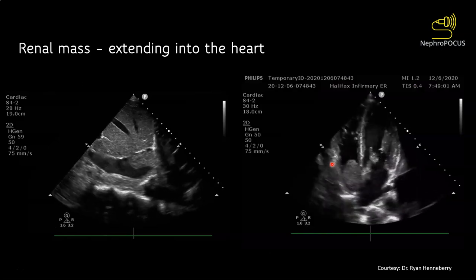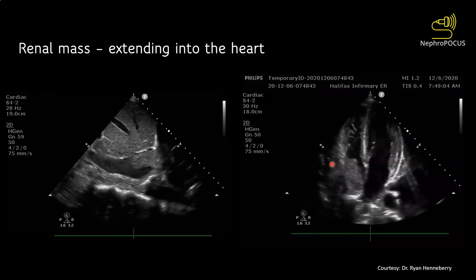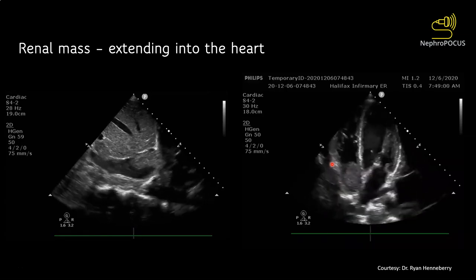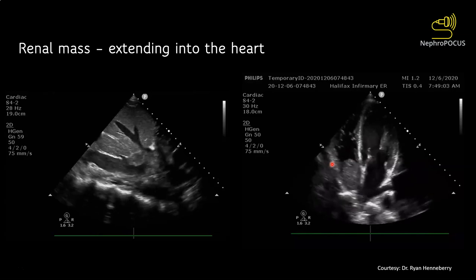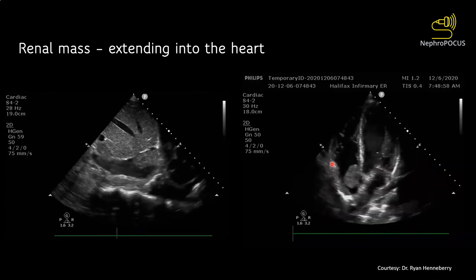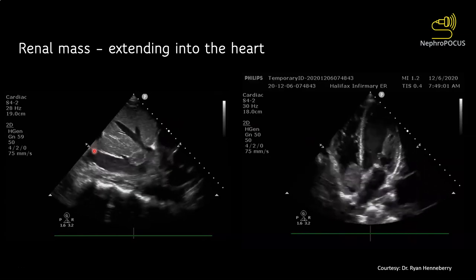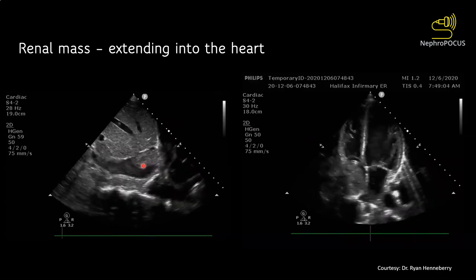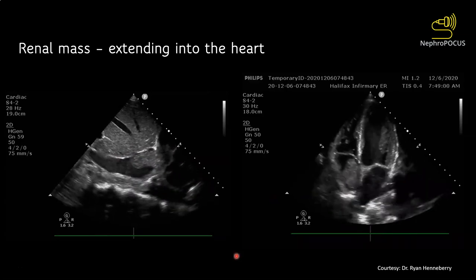Not only during kidney POCUS — you might also encounter metastatic kidney carcinoma when doing POCUS of the heart or IVC. Here is an example from a patient who had metastatic renal cell carcinoma with a tumor thrombus spreading into the inferior vena cava and into the right atrium.